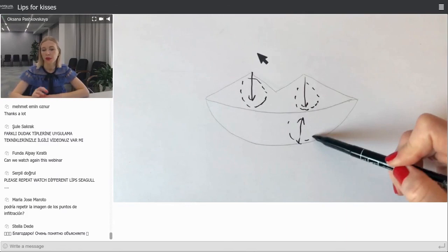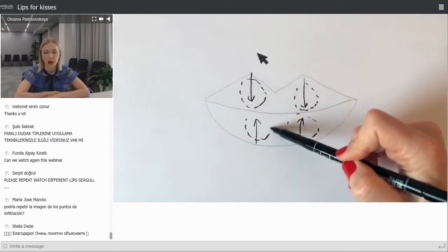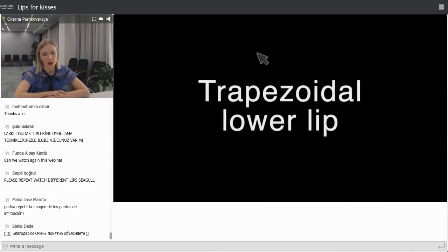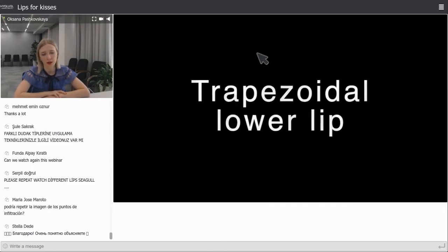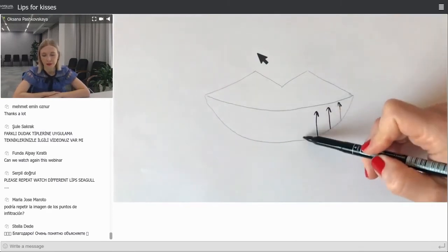So it could be maybe 0.1 to each bolus or 0.2. You should also pay attention to the lip, of course. It's a technique for refreshing, or when you are just going to start lip injection, you should try this technique.